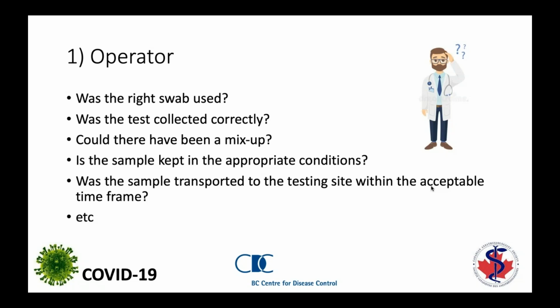So a bit about the operator. Is the operator using the right swab? There are a number of different swabs out there, each with its own potential contribution to the clinical performance. Was the test collected correctly? Was there sufficient sample on the swab? Was an NP done when it's required, as opposed to a nasal swab? Could there have been a mix-up with another patient? And we certainly have seen that happening.